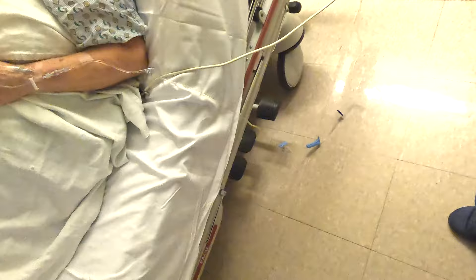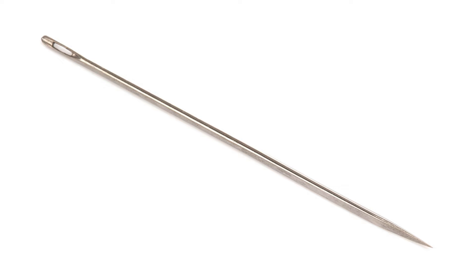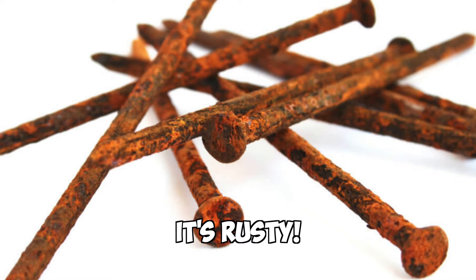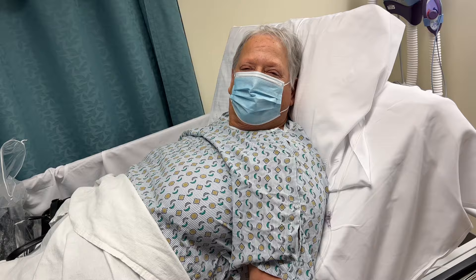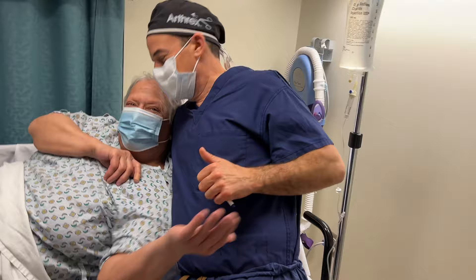You've never had so much fun coming to the hospital. When you're done you get chicken soup - I shouldn't have told you. You want this needle when we get it out, right? She's gonna frame it. It looks a little rusty. You think we're gonna get it out of here? I hope so.